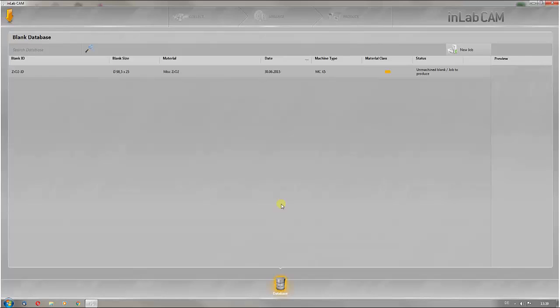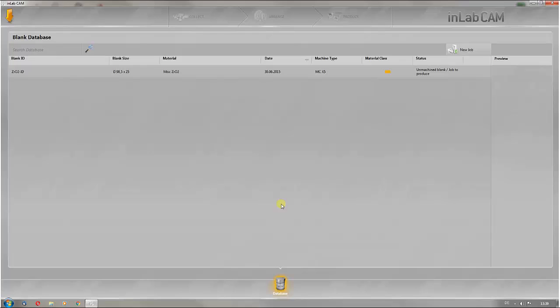InLab CAM Software 15 is the production software for the InLab system. This software controls the two production units InLab MCXL and InLab MCX5. The basic setup of the InLab CAM Software 15 corresponds to the setup of the InLab Software 15.